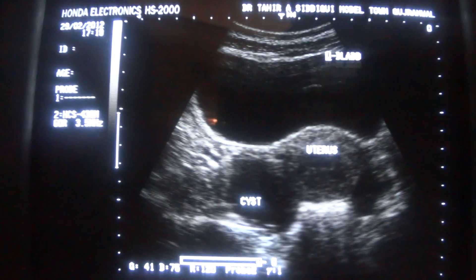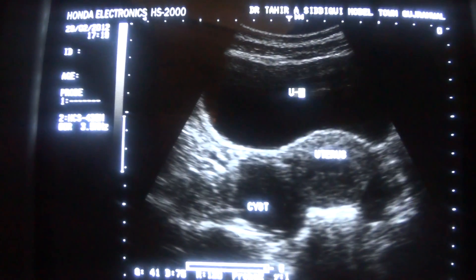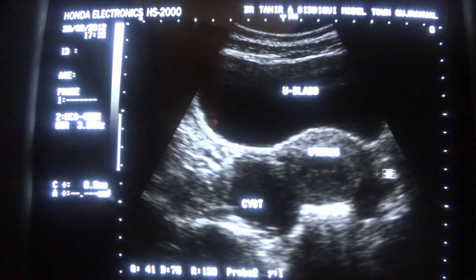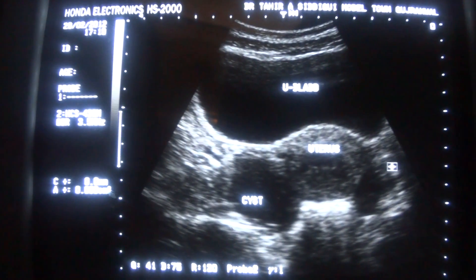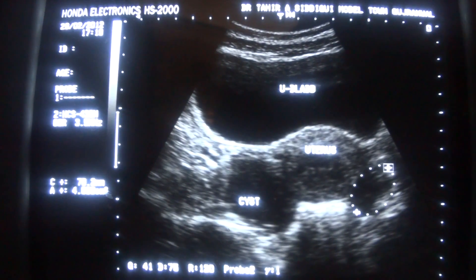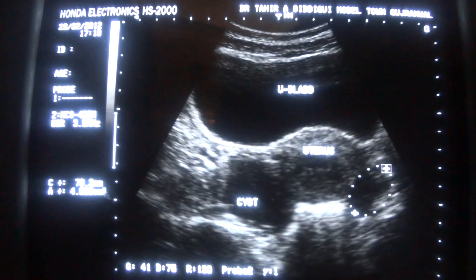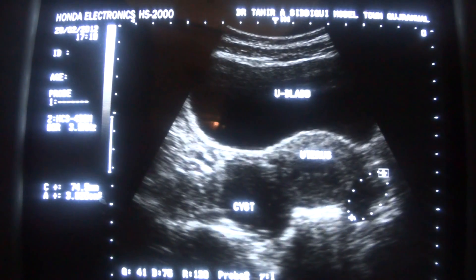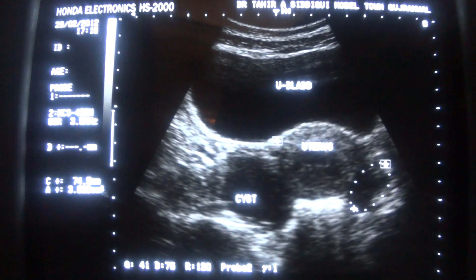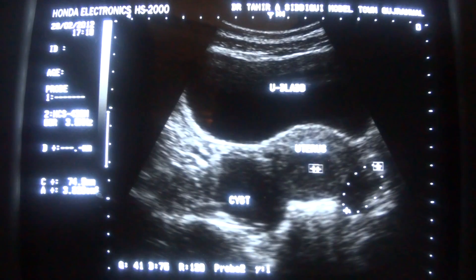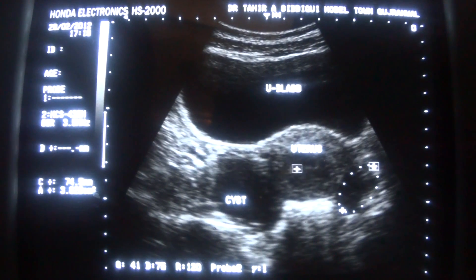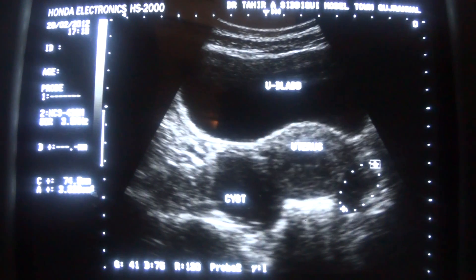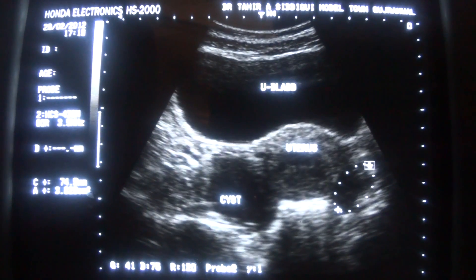This is the urinary bladder. This is the left ovary, showing follicular development. And this is the endometrial canal, which is in the proliferative phase, thin.